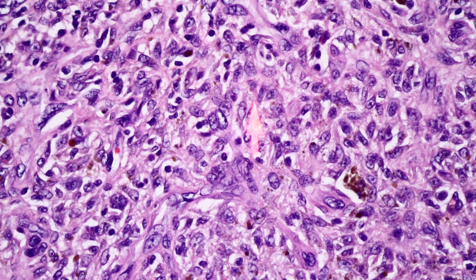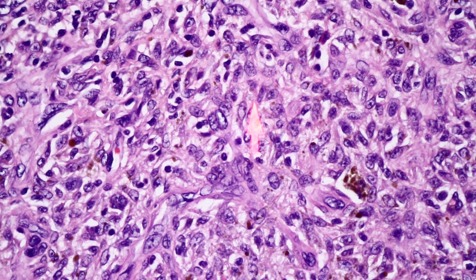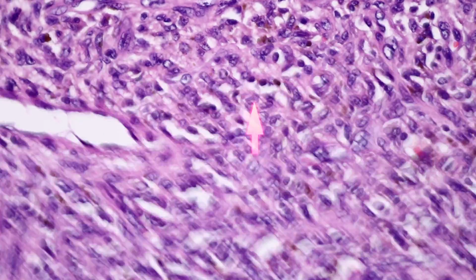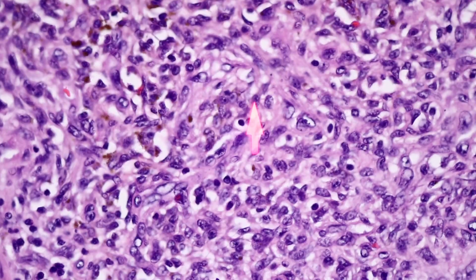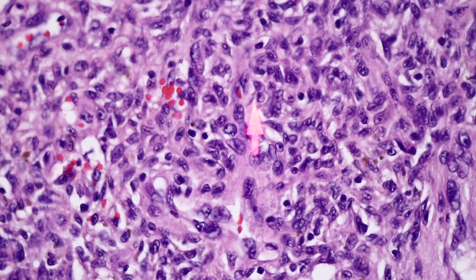So I find the presence of large cells that are plump and oval to round in shape to be useful pointers towards a dermatofibroma versus, say, a DFSP, which would have very slender, thin cells, and they wouldn't look like this. So the large cells, totally fine. Mitotic figures, even though I'm not finding them right away here, I know they're present elsewhere on the slide. And again, mitotic activity is a common feature in dermatofibromas, particularly the big deep ones like cellular dermatofibromas or aneurysmal dermatofibromas, which is what this is actually.